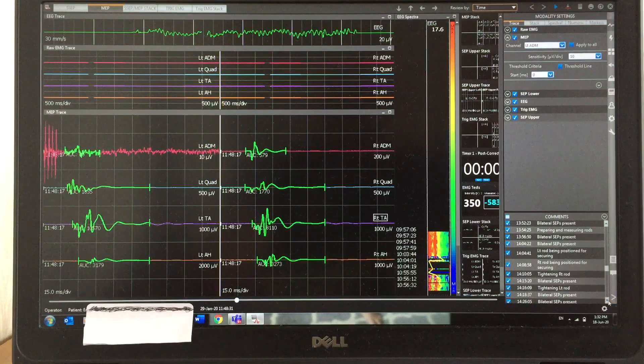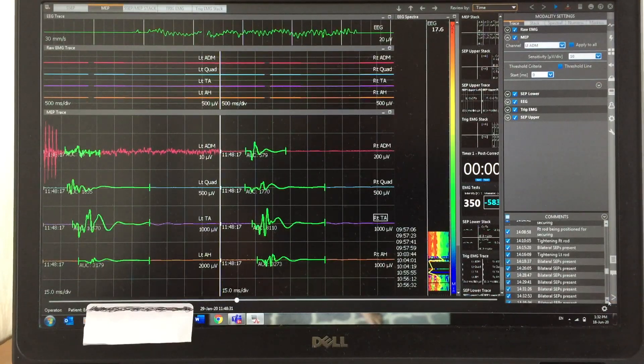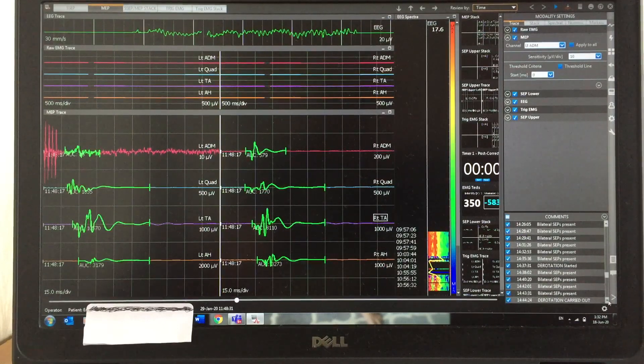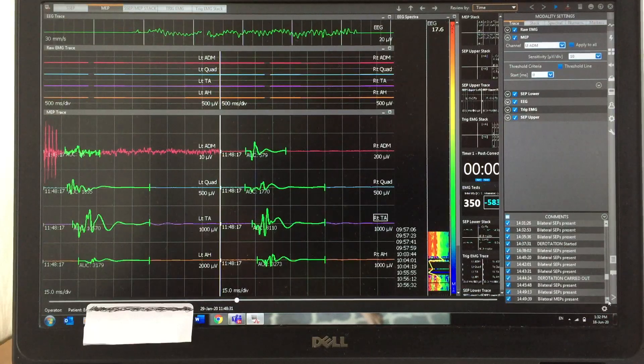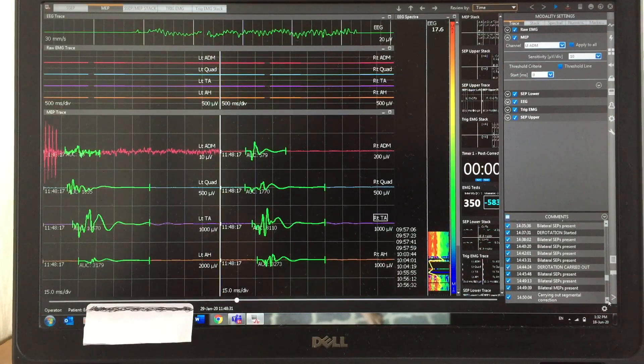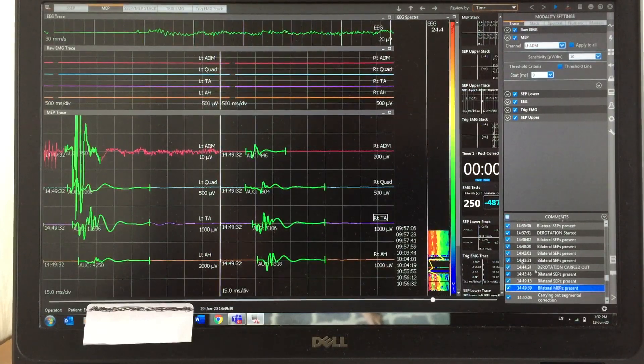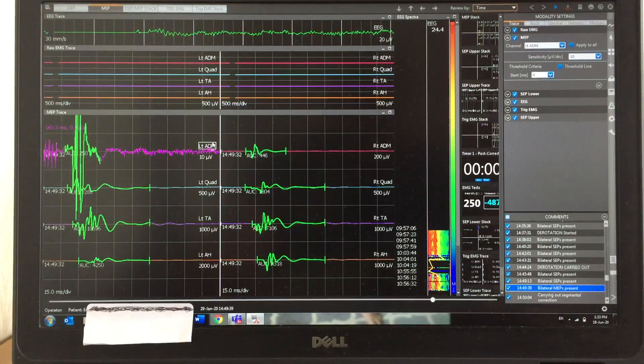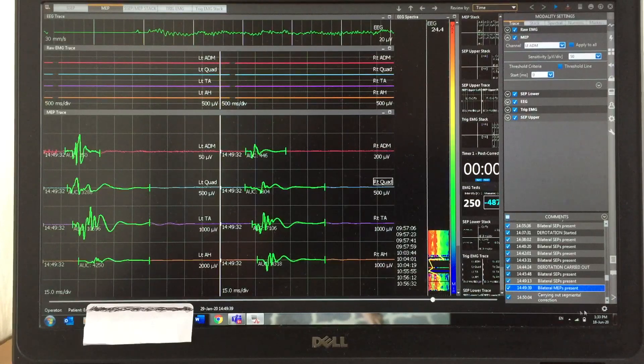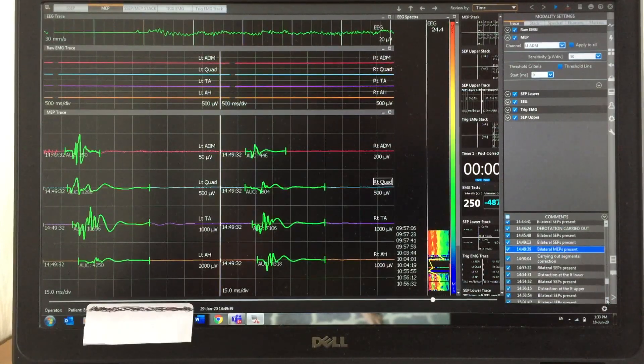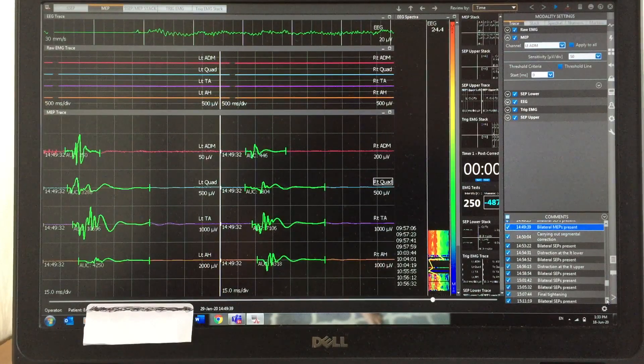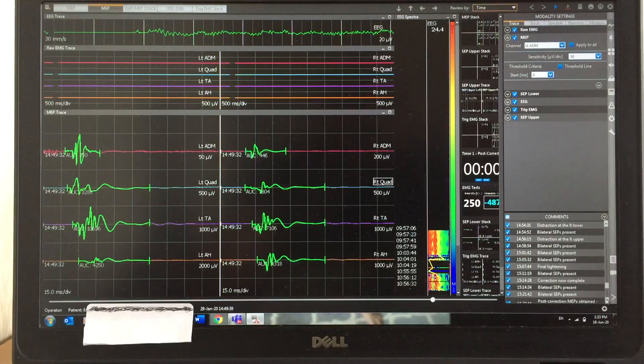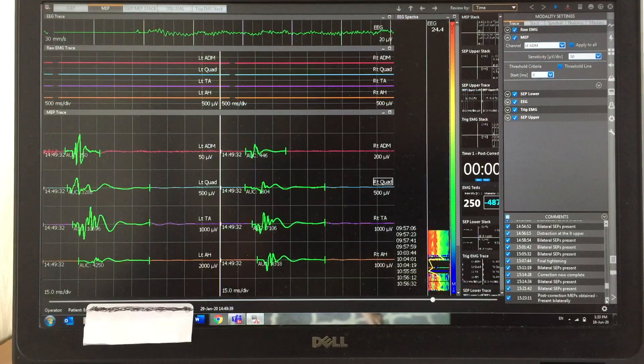Quite often you can see bilateral SEPs present, which means I am recording the SEPs continuously. After the derotation I took one MEP response. It looks perfectly all right when compared with the baseline recording, so I'm happy with the monitoring.